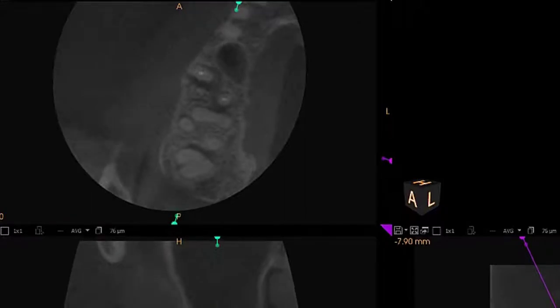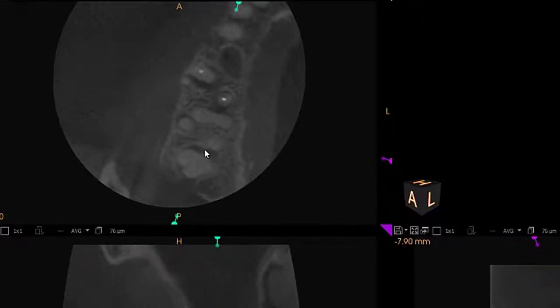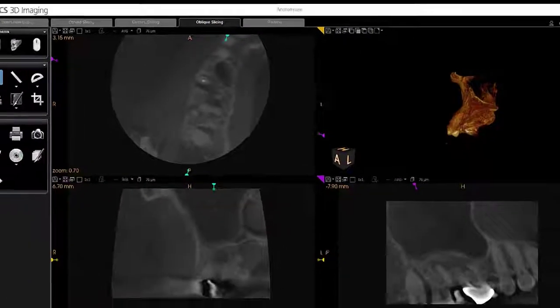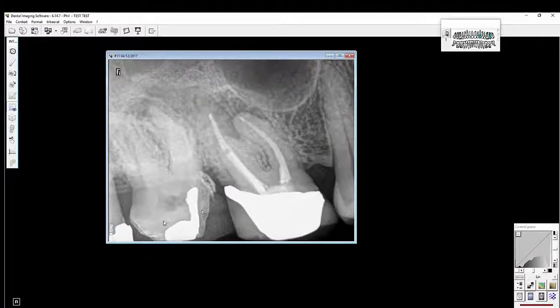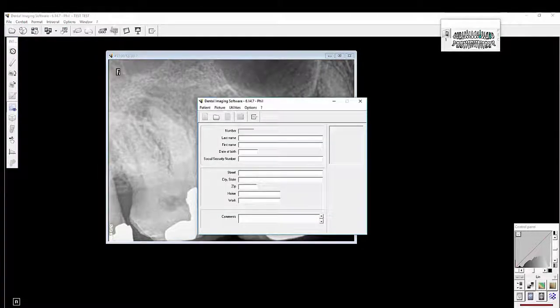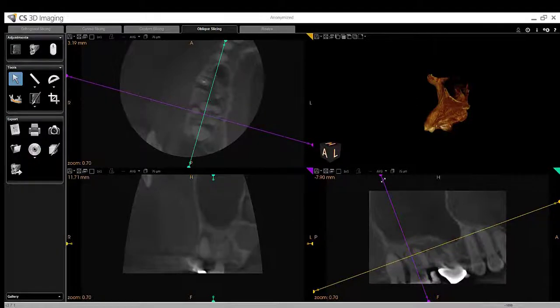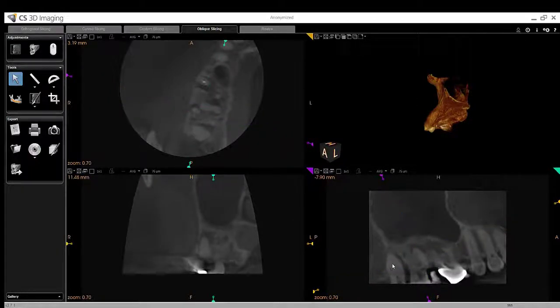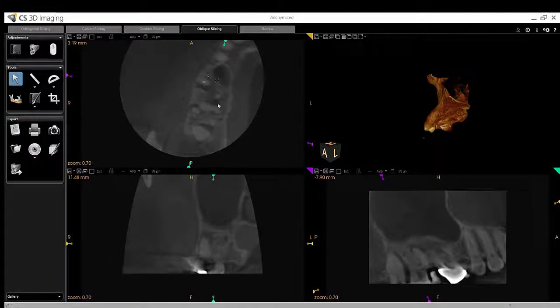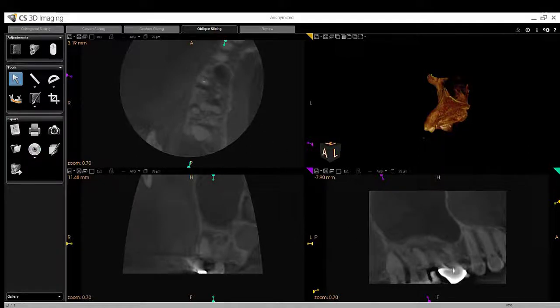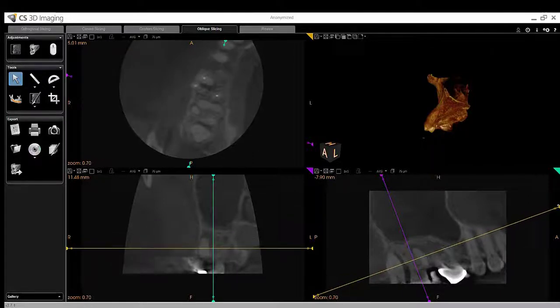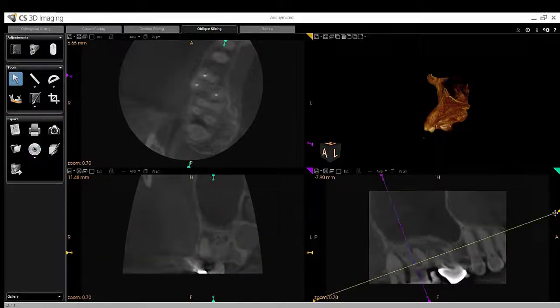My plan moving forward would be to initiate endodontic therapy on tooth number two, which did pulp test non-vital. Going back to the radiograph, we can see a recent crown prep close to the pulp, and there's a large ML amalgam in that tooth — so the etiology is likely the large cavity that was on that tooth previously. I'm going to move forward with non-surgical endodontic therapy on tooth number two and extract tooth number one. Then my plan is to wait for this to heal and see if the lesion associated with tooth number three may actually be from tooth number two, as I may not want to have to pull the post out of tooth number three — it may only need endodontic therapy on the buccal roots.